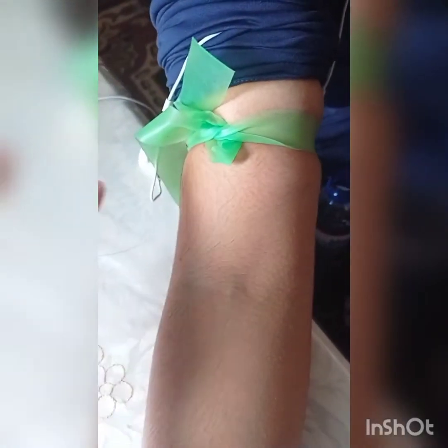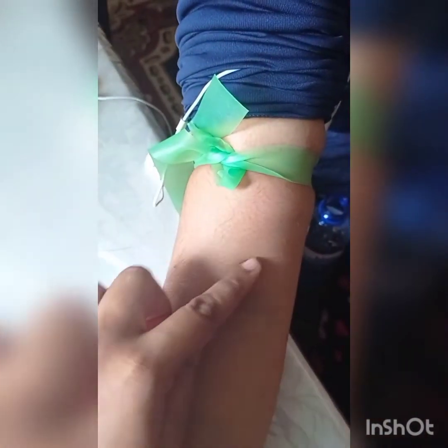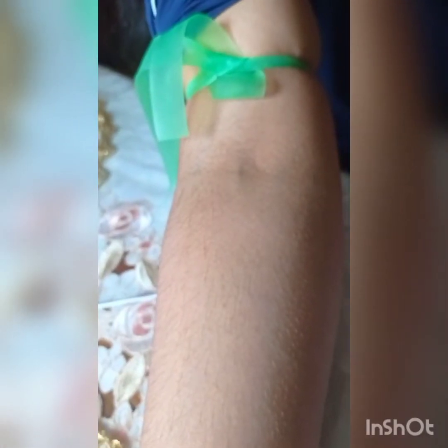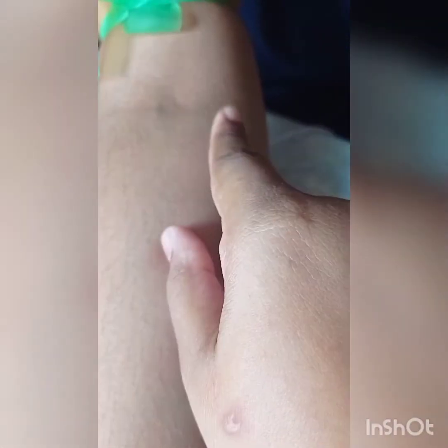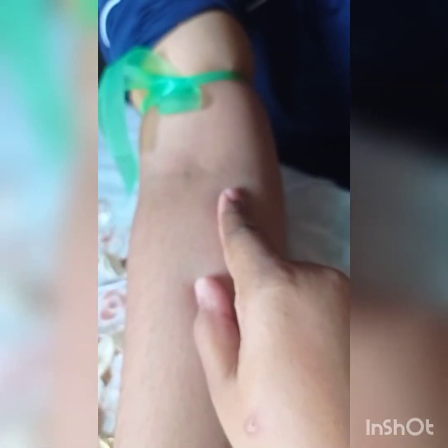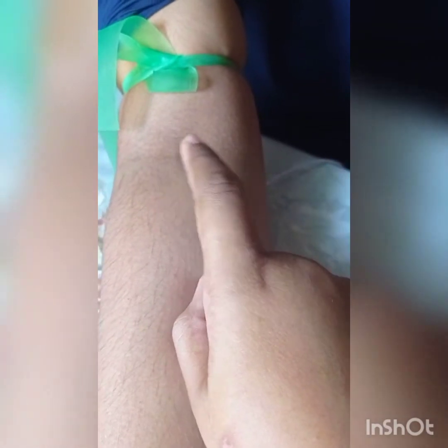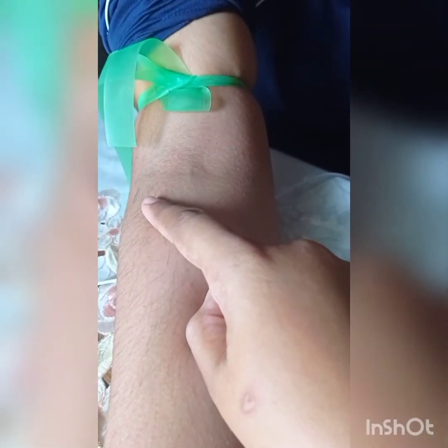So as you can see, the tourniquet is tied off 3 to 4 inches above, and around here the antecubital fossa is exposed. So here are the veins where we, as phlebotomists, have to bore the patient. As I said, here we have 3 types of veins: the median cubital vein, the cephalic vein, and the basilic vein. As I said, the first choice is median, the second choice is cephalic, and the last choice, but not least, is the basilic vein.